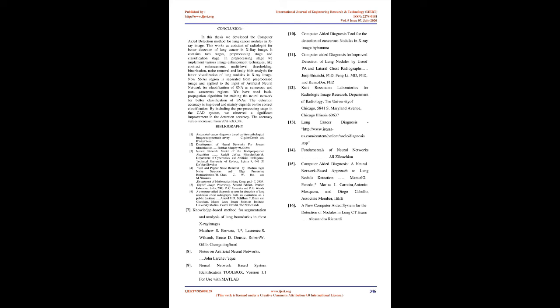Conclusion. In this thesis we developed the computer-aided detection method for lung cancer nodules in X-ray image. This works as an assistant of the radiologist for better detection of lung cancer in X-ray image. It contains 2 stages, pre-processing stage and classification stage. In pre-processing stage we implement various image enhancement techniques, like contrast enhancement, multi-level thresholding, binarization, noise removal, and lastly blob analysis for better visualization of lung nodules in X-ray image.